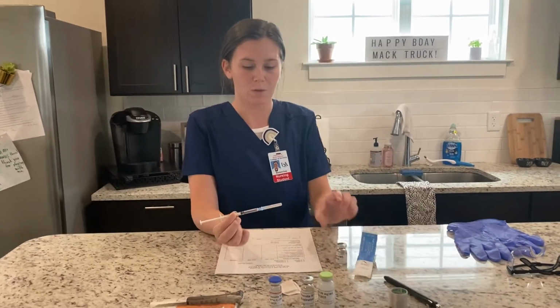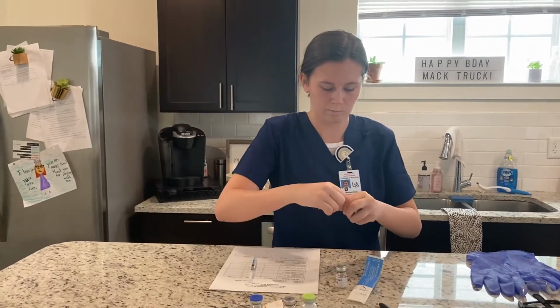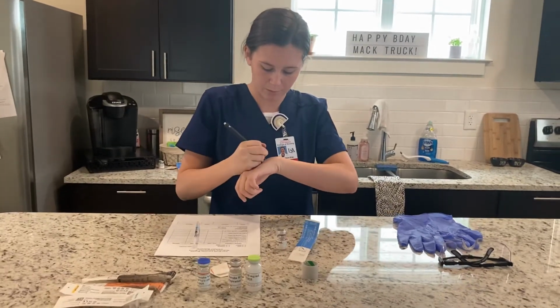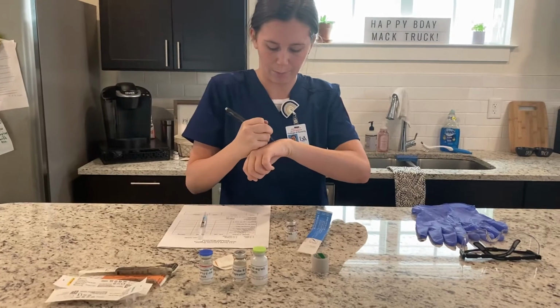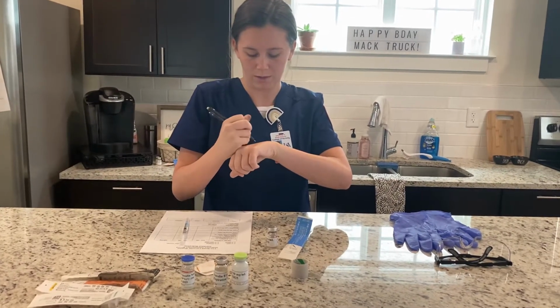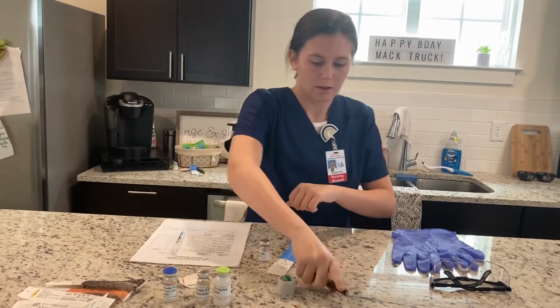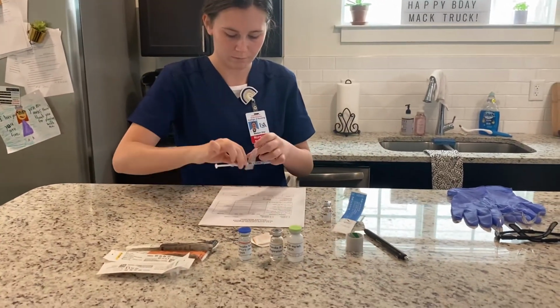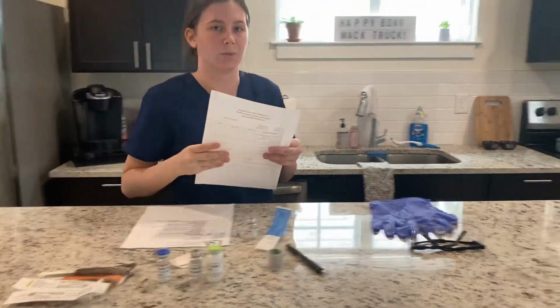So now I'm going to make my label. On my label, I'm going to write the patient's name, Jaguar Jones, the medication, heparin, and then the dose, 5,000 units or 0.5 milliliters, and I'm also going to initial it. And then I'll place this on my syringe. And I'm going to take this with me to the patient's room.